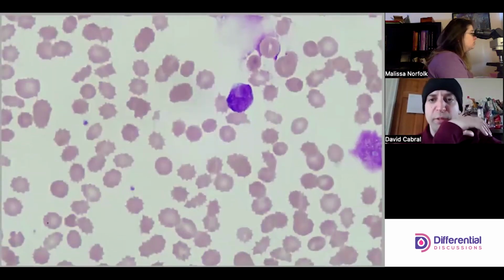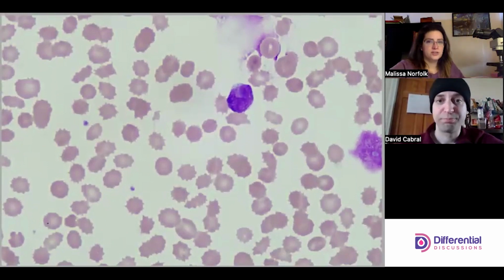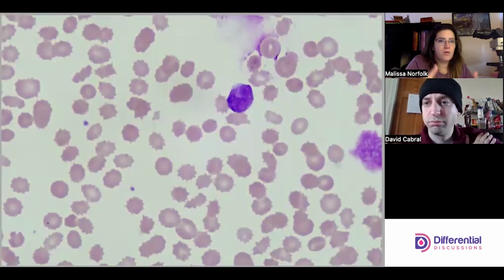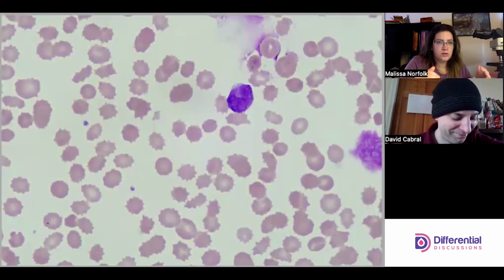But definitely chromatin pattern on ALLs is sometimes very challenging. Yeah. Because the other thing too is you don't want to hem and haw over a cell. Absolutely. If this is a new ALL that you're sitting at the bench, you're going to do a count, leave it for the pathologist, and they're going to run flow.